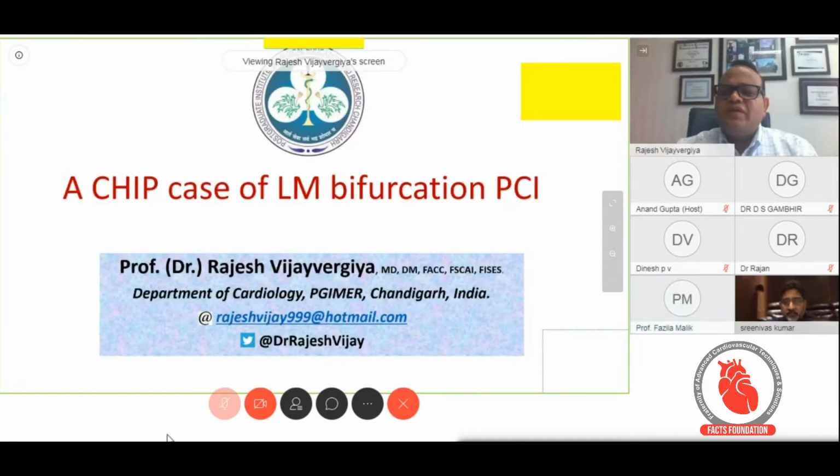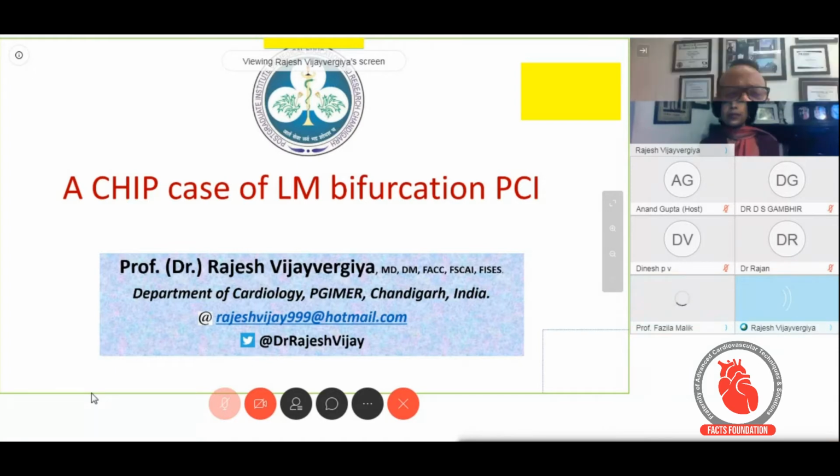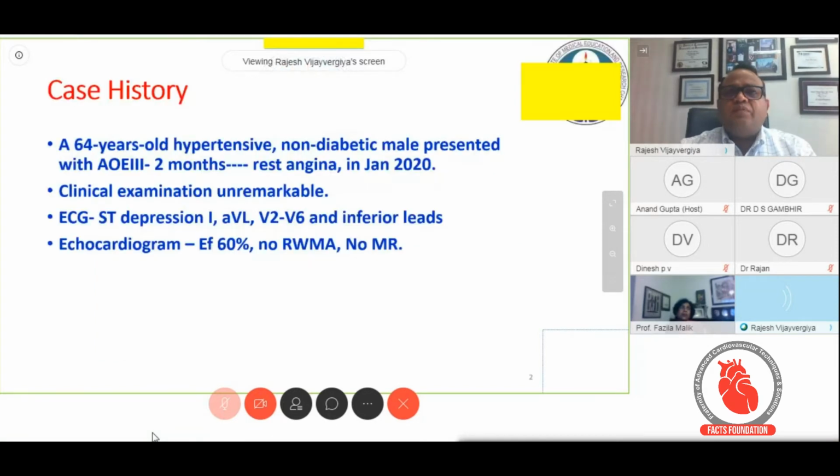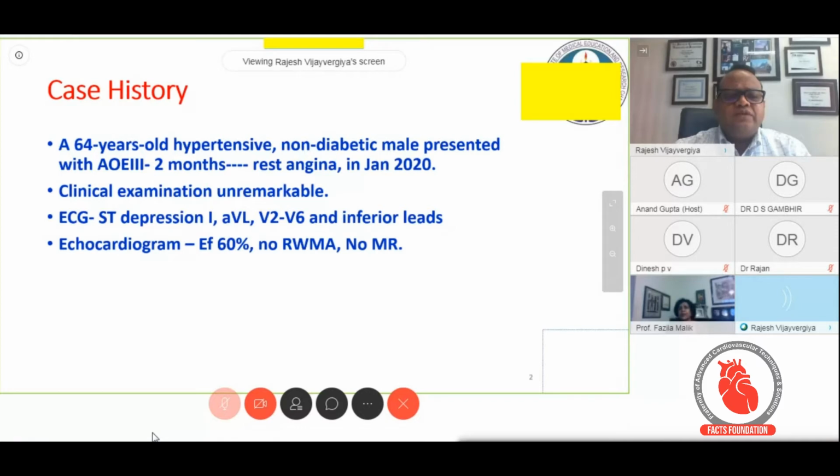Go ahead. Okay. So good afternoon, everyone, and thanks, Medtronic, for this bifurcation left main webinar. Let me go ahead with my case. This is a case of a 64-year-old hypertensive non-diabetic male who presented with angina on exertion class 3 for the last 2 months and rest angina later on in January 2020. Clinical examination was unremarkable. ECG did show ST depression in lead I, AVL, V2 to V6 and inferior leads. Echocardiogram showed a normal ejection fraction.